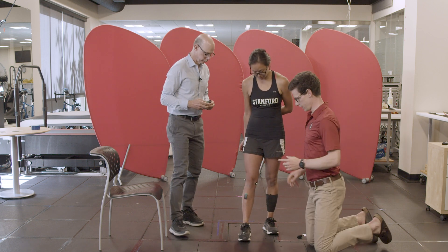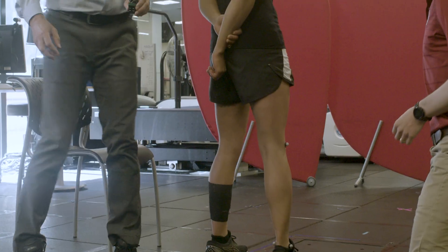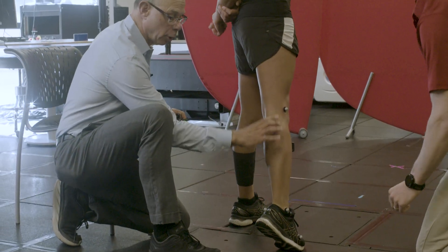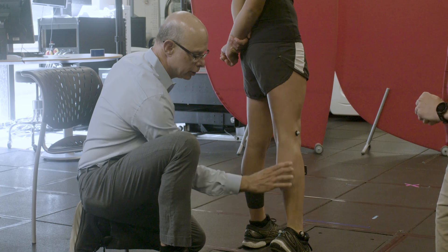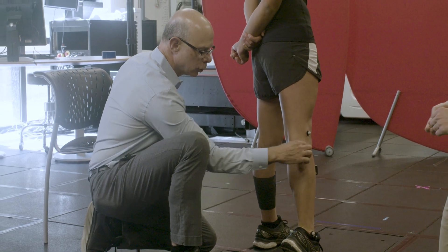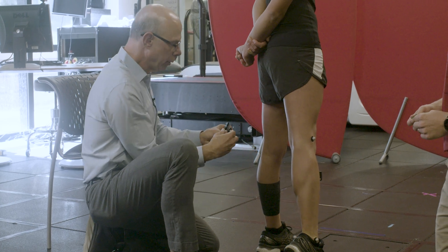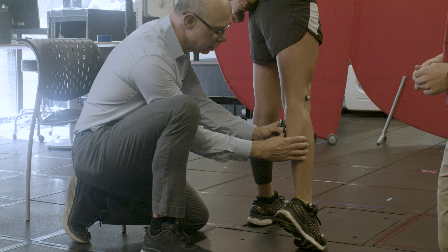So there's her tibialis anterior. We'll now do her gastroc medialis. The gastrocnemius medialis is in the posterior part of the calf; the Achilles tendon comes down here, and you can see the gastroc has two heads — a lateral head and a medial head. We'll place this electrode on the medial gastrocnemius.